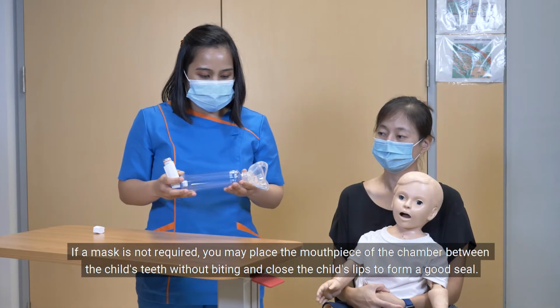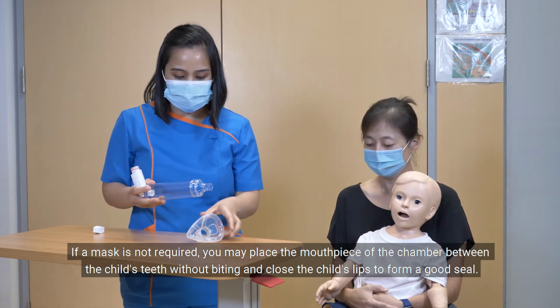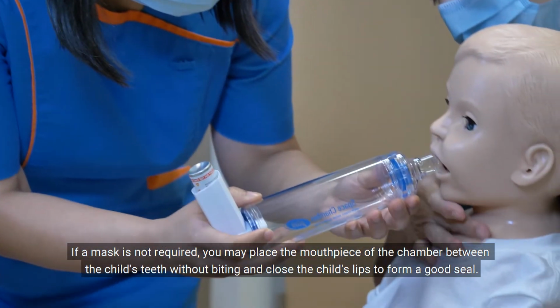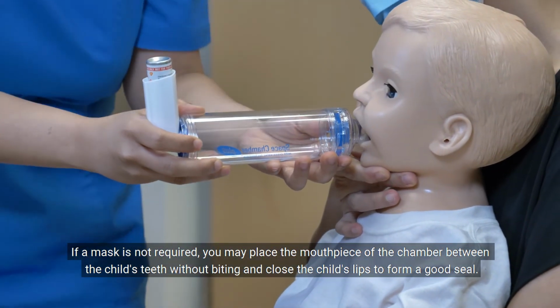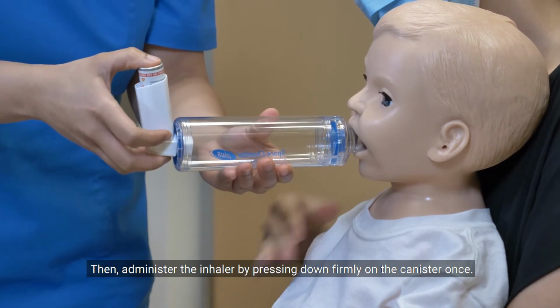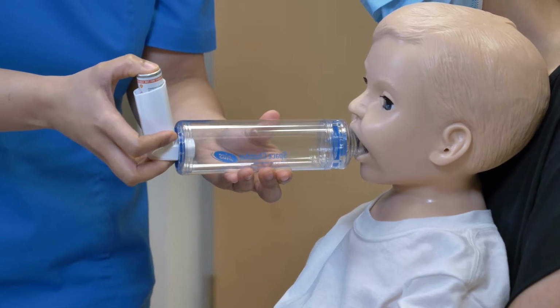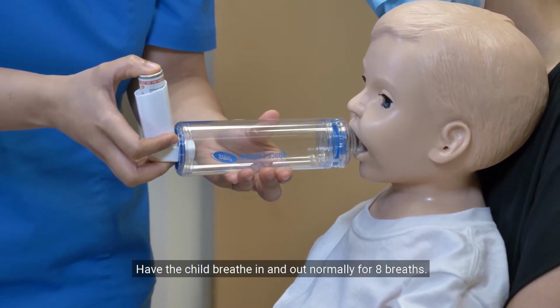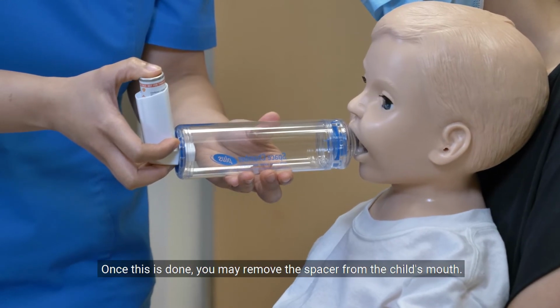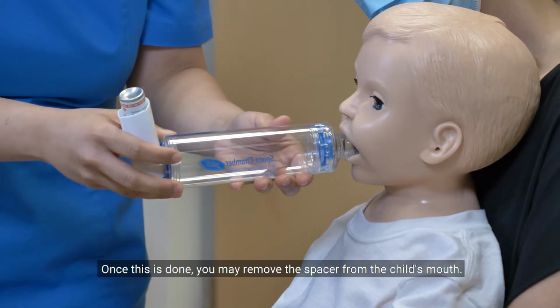If a mask is not required, you may place the mouthpiece of the chamber between the child's teeth without biting and close the child's lips to form a good seal. Then, administer the inhaler by pressing down firmly on the canister once. Have the child breathe in and out normally for 8 breaths. Once this is done, you may remove the spacer from the child's mouth.